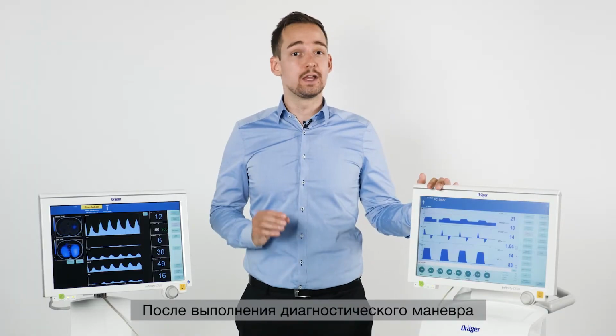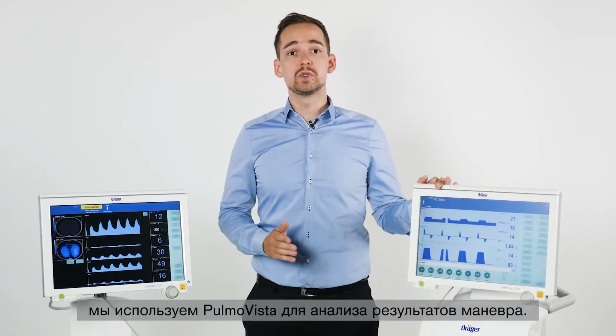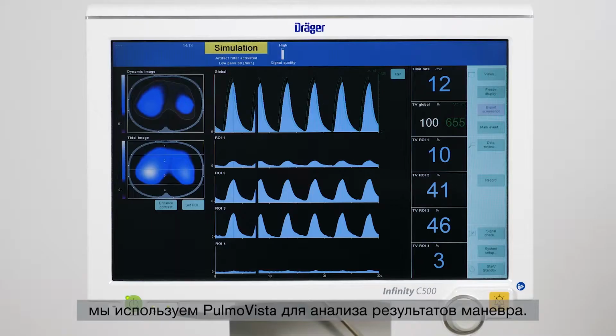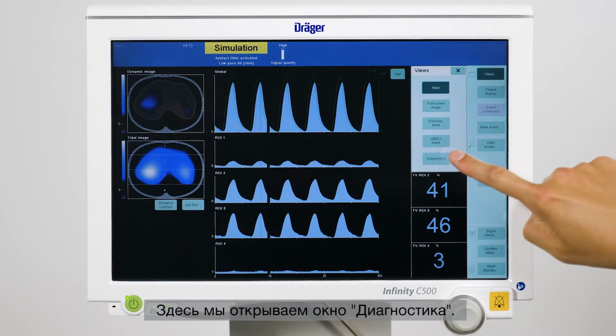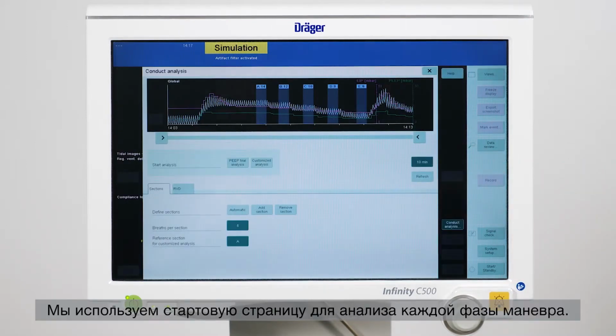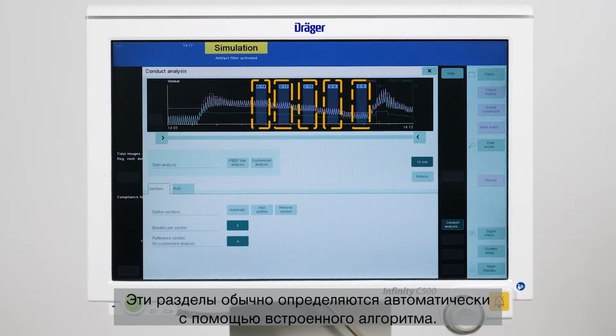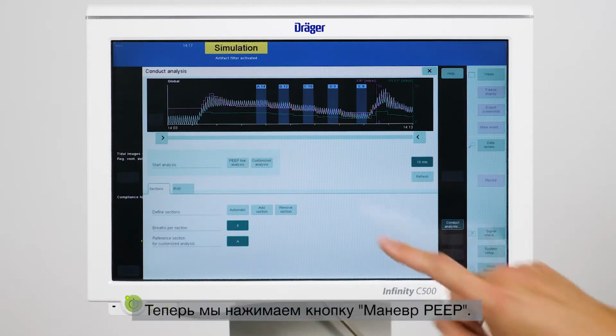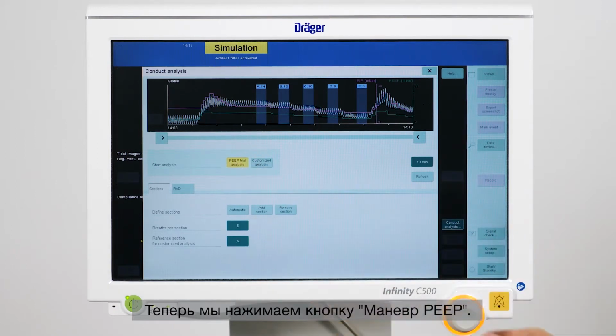After performing the diagnostic maneuver, we use PulmoVista to analyze the PEEP trial. Here we open the diagnostic view. We use the start page to define analysis sections for each step of the trial. These sections are usually found automatically by the built-in algorithm. Now we simply press the button PEEP Trial Analysis.